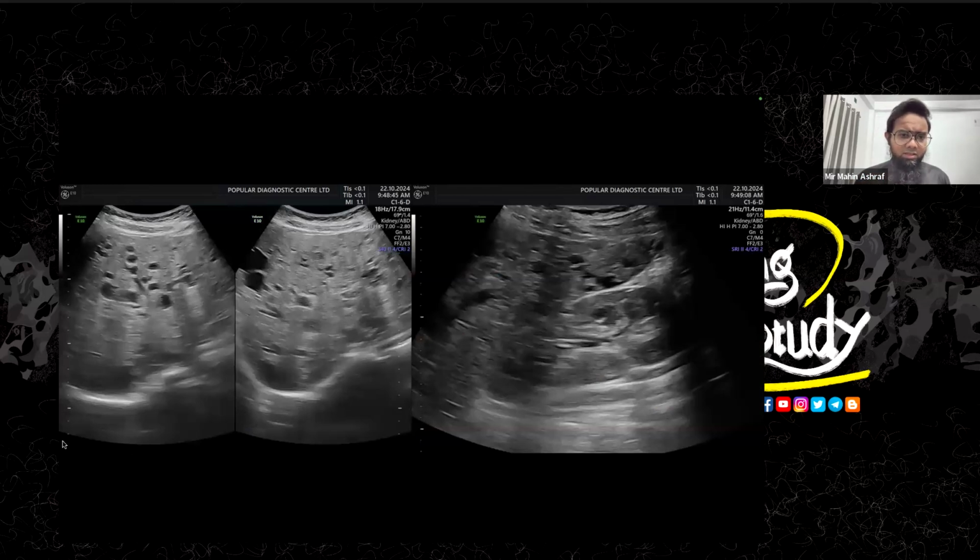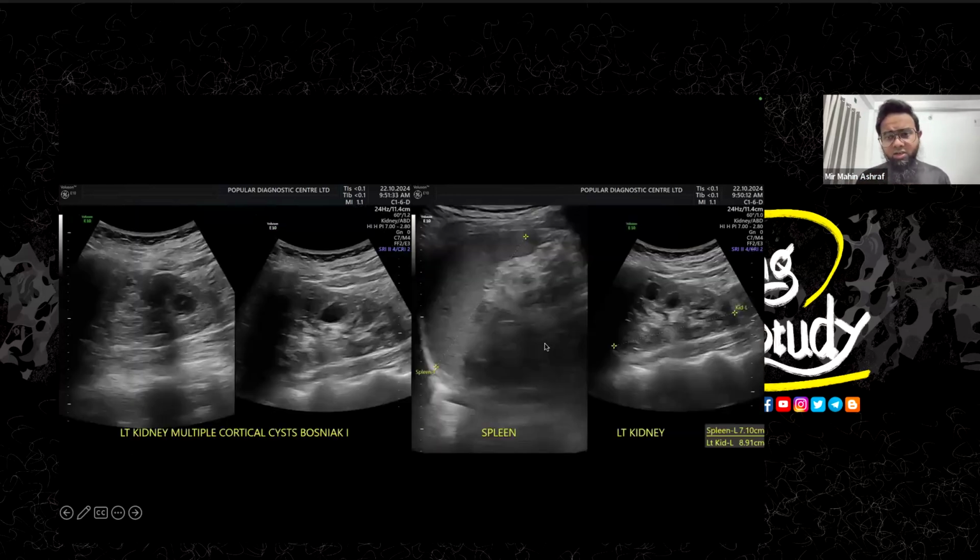Now we can see the cystic lesions here also, and you can also see the kidney on the right side. When we jumped into the left kidney, we also found some cystic lesions in the left kidney. These are not very prominent features; rather, the liver is more involved here. But you know, we can demonstrate these cystic lesions with 3D ultrasound. I'm not here to show you just the hepatic cyst, so definitely I have a plan to show you.